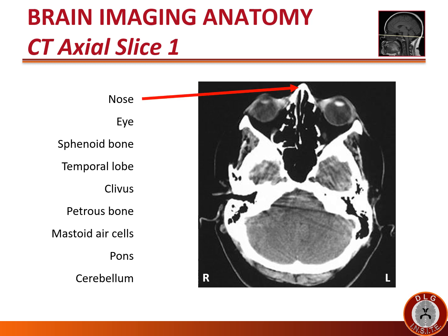I'm guessing you had minimal difficulty identifying the nose. The eyes also are not difficult to identify. Note the hyperdense or white oval-shaped structures in the anterior aspects of the eyes are the lenses.